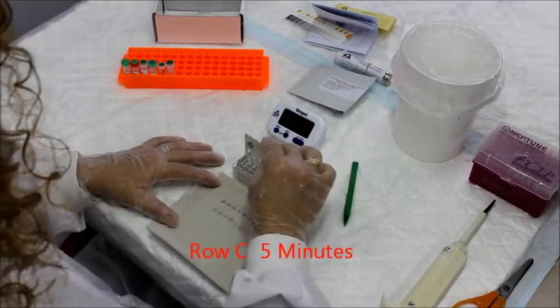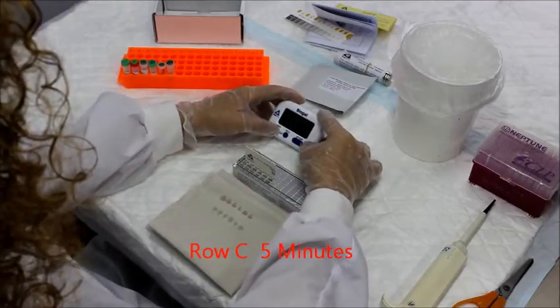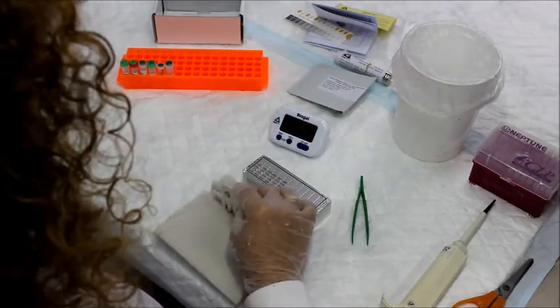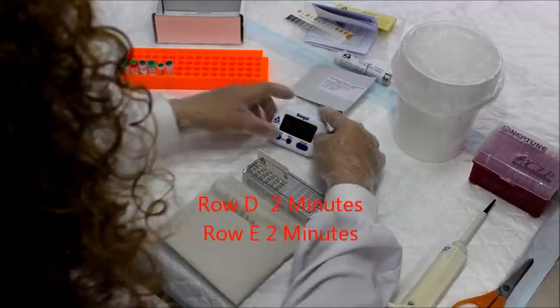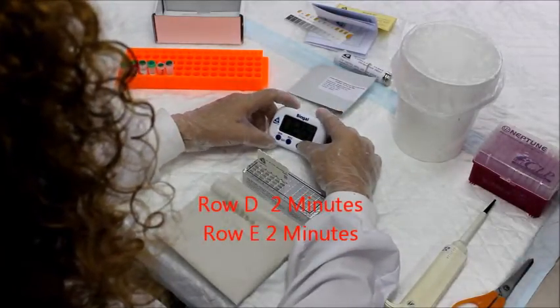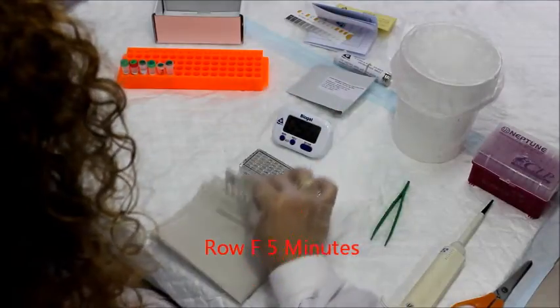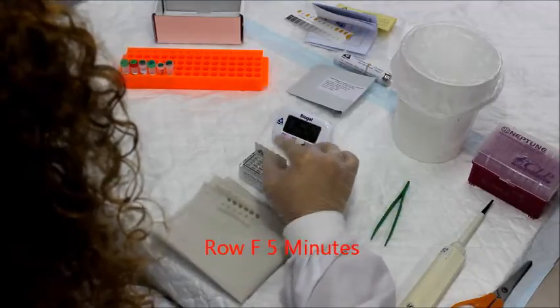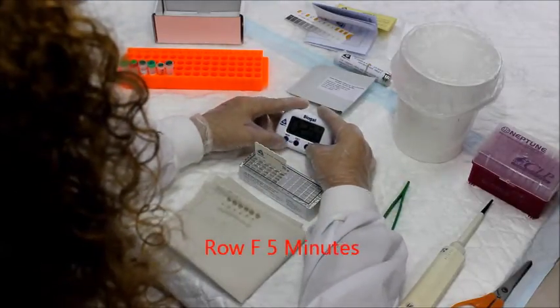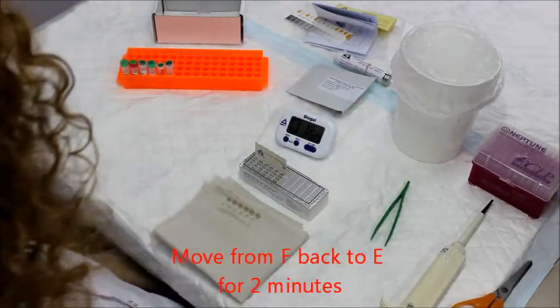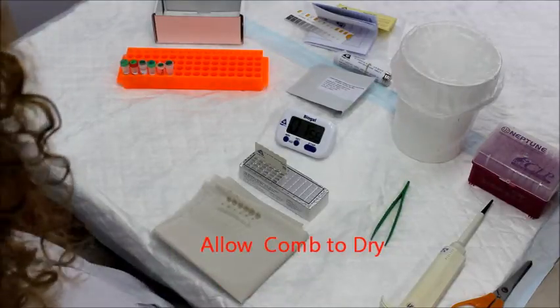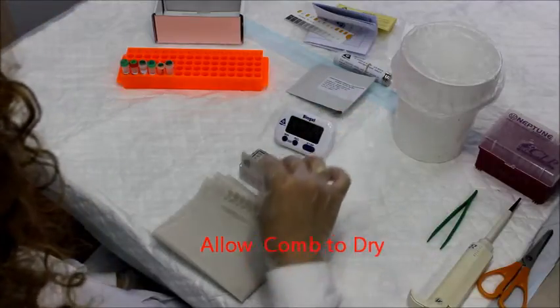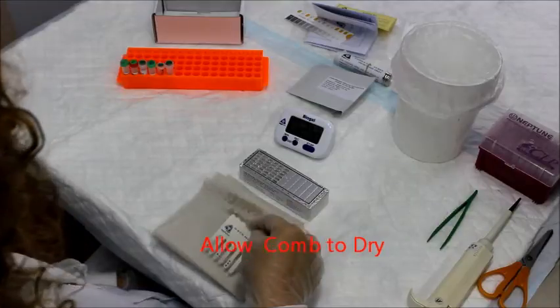Place the comb into the remaining wells, row D and E, for two minutes and the last well, which is row F, for five minutes. Upon completion of the color development in row F, move the comb back to row E for the next two minutes for color fixation. Take the comb out and let the comb dry for one to ten minutes.